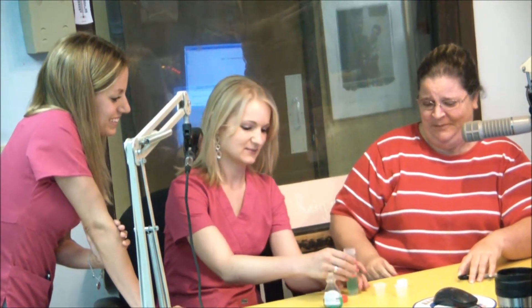And then the last step, you want to run your tongue around your mouth, between your cheeks and everywhere, and whatever you can collect, you also want to spit that into the tube. And then after you spit, you'll do it one more time — run your tongue around your teeth and everything, and do it again. At this point, I think she'd prefer you brought a needle. That's going to be kind of gooey.